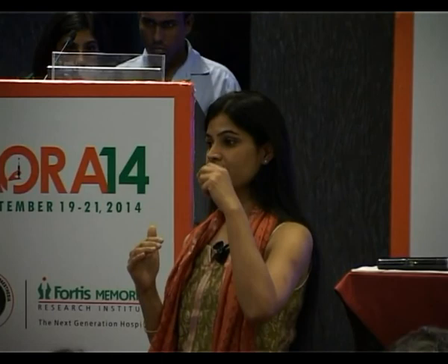When people did it blind all the time, you felt two pops. I'm not good with feeling those pops. So then you move your transducer in the transverse plane more laterally. Keep following that fascia iliaca. You will see the iliacus. So they almost come together. It's the fascia lata and the iliaca. Below that is the iliacus, iliopsoas.